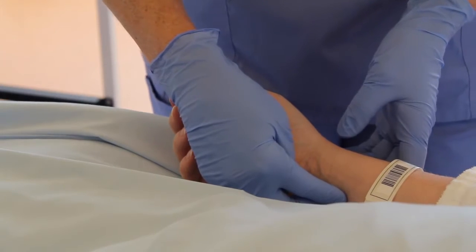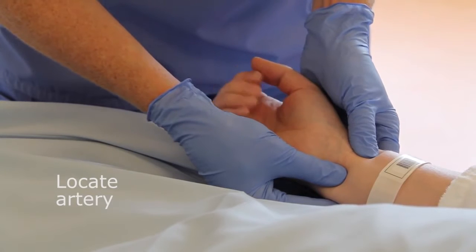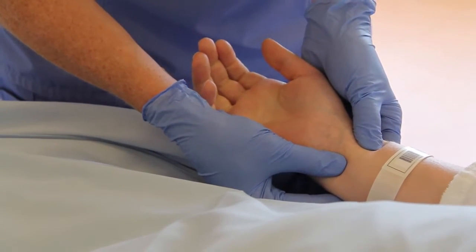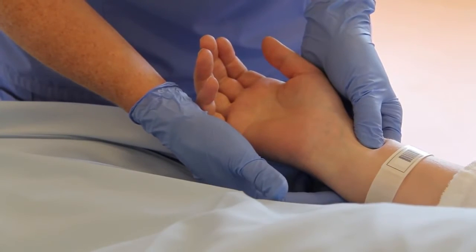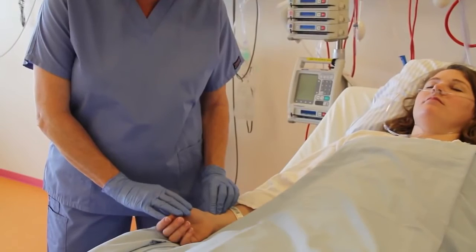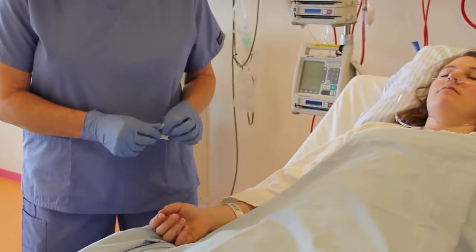Locate the artery and palpate it for a strong pulse. If recommended by your hospital's procedures, you can perform the Allen's test. Clean the puncture site with an alcohol swab.